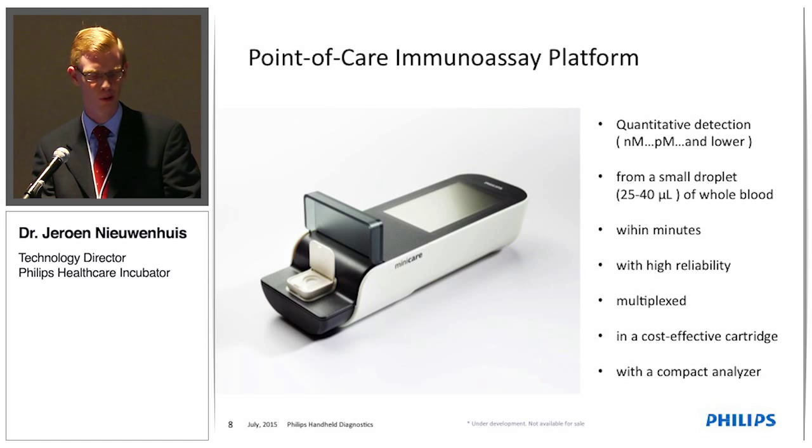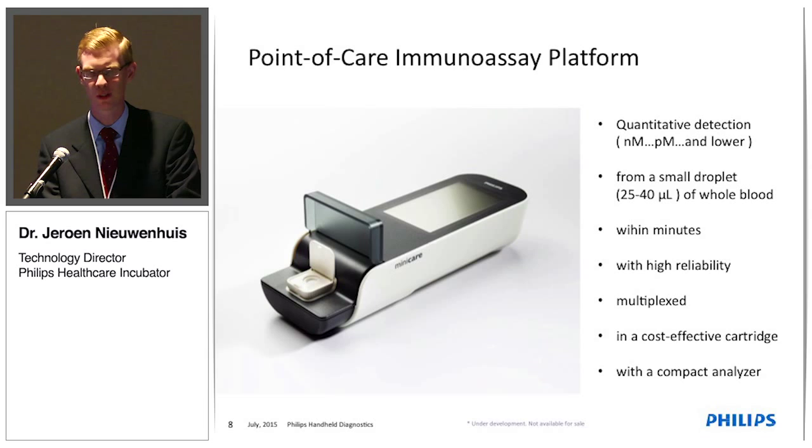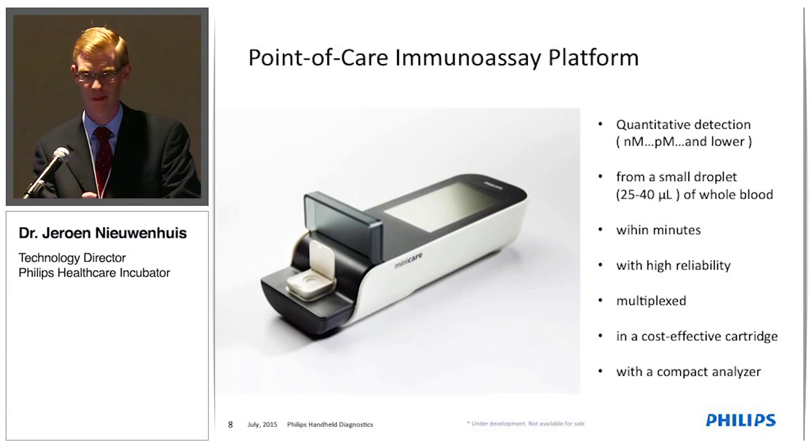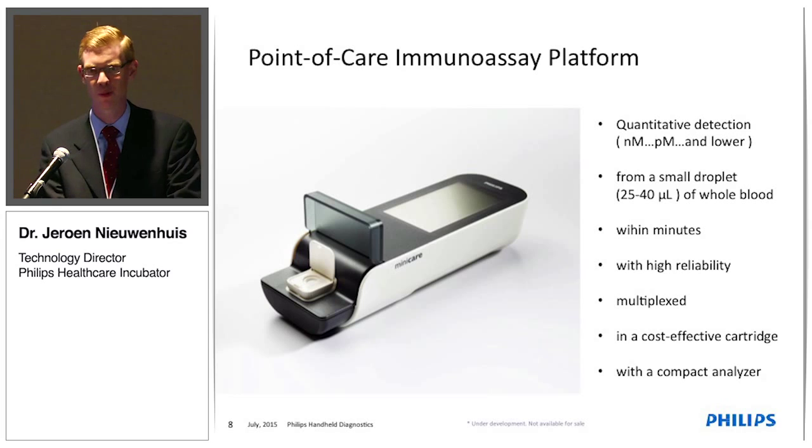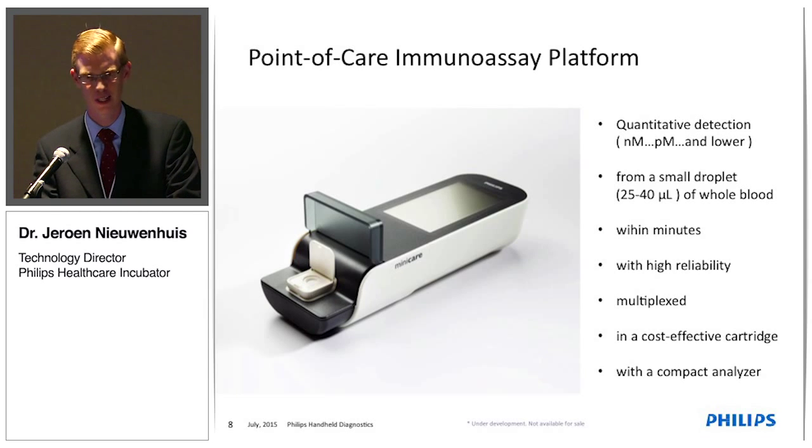Since this model is all based on sales of the reagents, it's very important to have a low-cost disposable, so we spent quite some effort to reduce the number of components, keep the fluidics simple, but also make sure that we only use passive injection molded plastic components for the disposable, and use very small amounts of reagents. To give you an impression, the antibody spots that we deposit in the system require about 2 nanoliters of sample each. So reagent costs are tiny, less than a cent per cartridge.